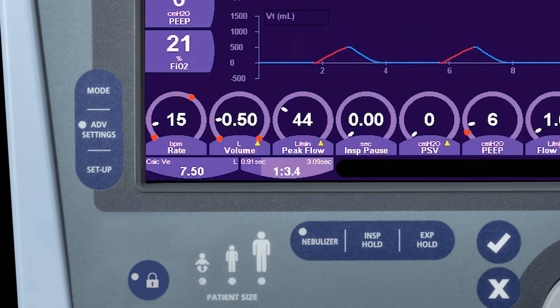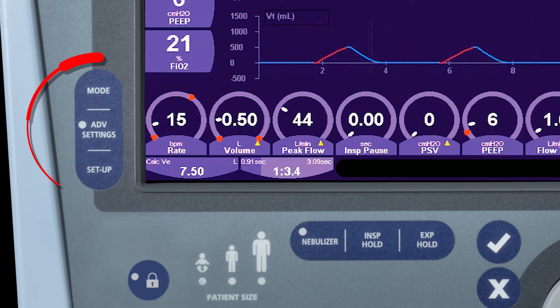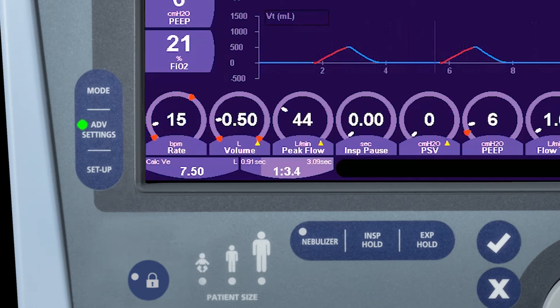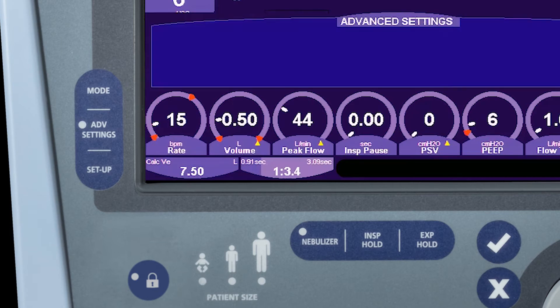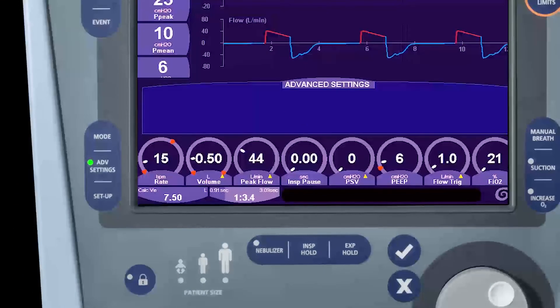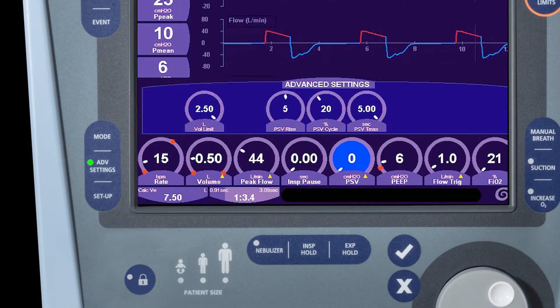To access the advanced settings, we open the advanced settings window by pressing the advanced settings button on the front of the ventilator. If we select a primary control now, we will see the associated advanced settings that can modify it.